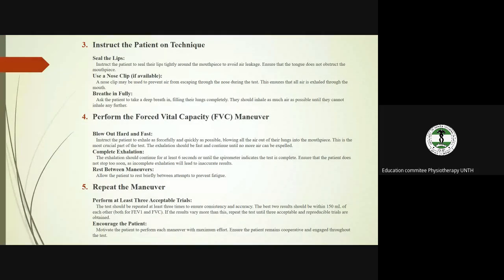Sometimes you can tell the patient to hold the breath. In the children clinic, if you tell them to put a clip on their nose, some of them will be so afraid. So what you do is tell the child, hold your breath. The baby will hold the breath. Then you tell the patient to blow.